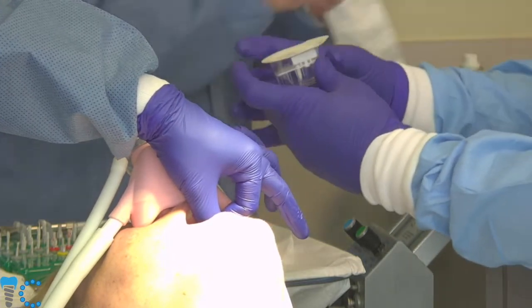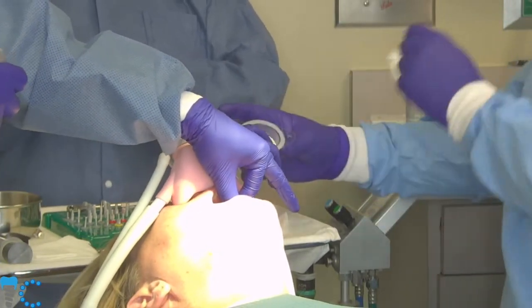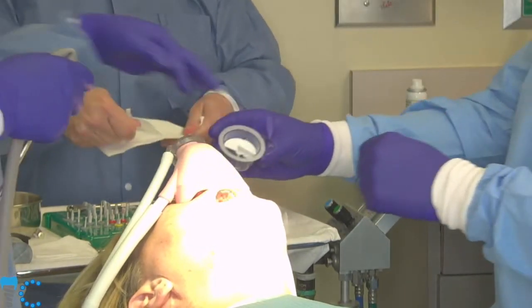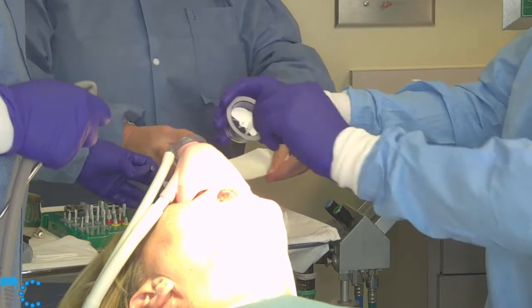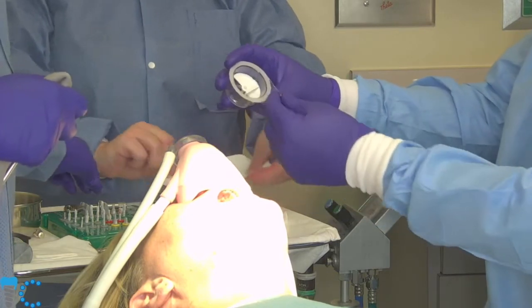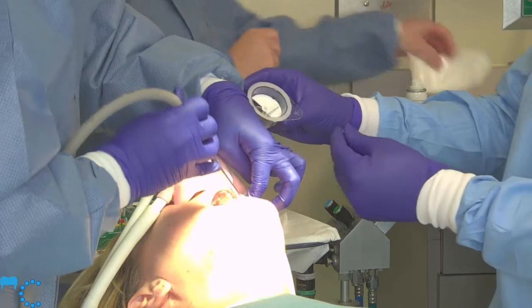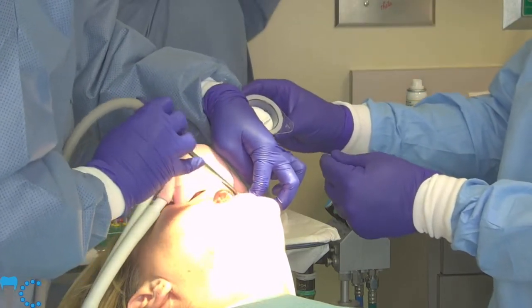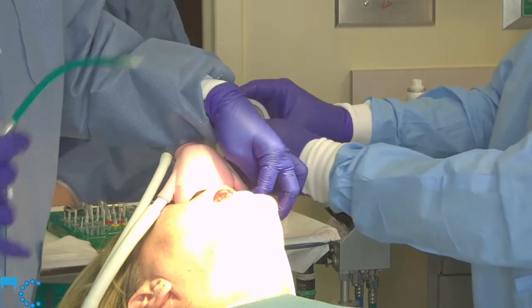So we're going to take our container here. We're going to open the peel pack, and we're going to flip this little lever there to expose our implant. This is a plasma autoclaved implant, so the implant has to be loose in here. So they've come up with some clever packaging to allow proper sterilization of the implant and pretty easy access to it.